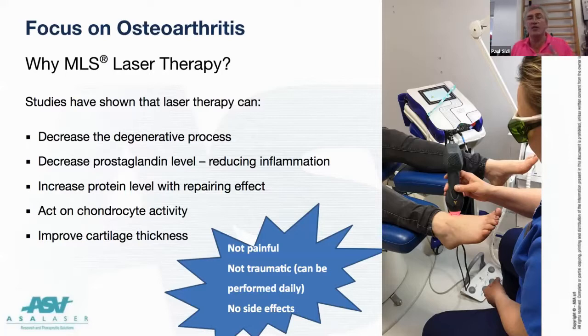Again, there are no nociceptors, no pain receptors in that articular cartilage. It's shiny, hard stuff. In that area of the foot, it's probably only 2 millimeters, whereas it's much thicker in the bigger joints like the knees. But the load which is going through that foot is just enormous. So we're hampered slightly by this. But the big thing that this laser is going to do is reduce pain.